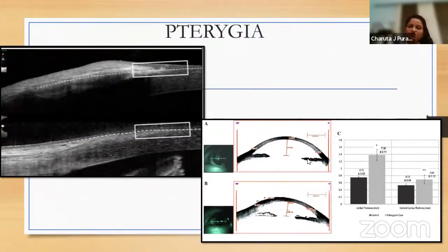Another important description is the high resolution OCT features of flat bridging of the corneoscleral transition zone, reduced thickness of the pterygium head, and a greater degree of corneal astigmatism, which is associated with scarring. There is another study which has shown that increased Zernike aberrations are found in the 5 mm zone of the cornea whenever the end of the pterygium exceeds 25% of the corneal diameter.